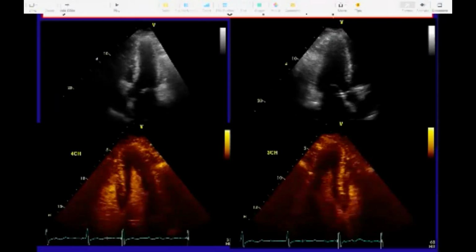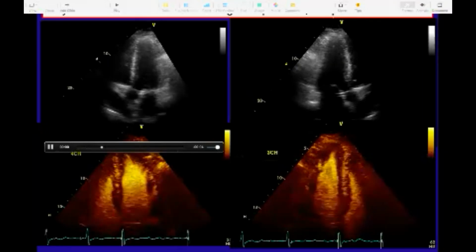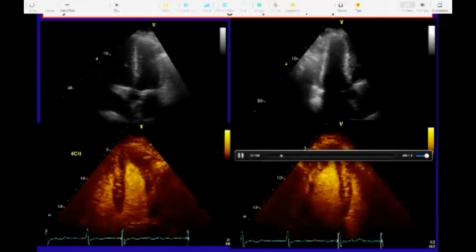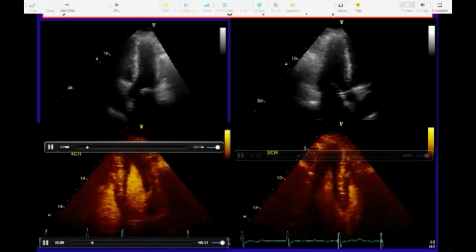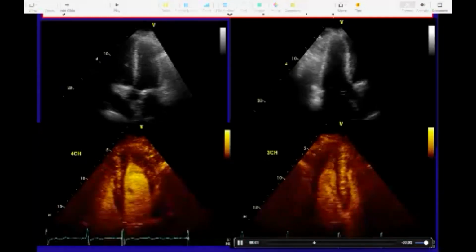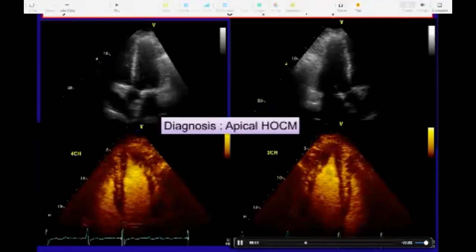Now, when we take it the next step to look at morphology, here is a case again where the mid to distal ventricle is challenging to see. If you only looked at the epicardium, you would even wonder whether there is a little bit of dyskinesia of that periapical segment. But lo and behold, when you actually give contrast, you can clearly see that there is no dyskinesis, rather that there is asymmetric thickening of the distal portions of the septum and periapical walls consistent with apical hypertrophic cardiomyopathy.